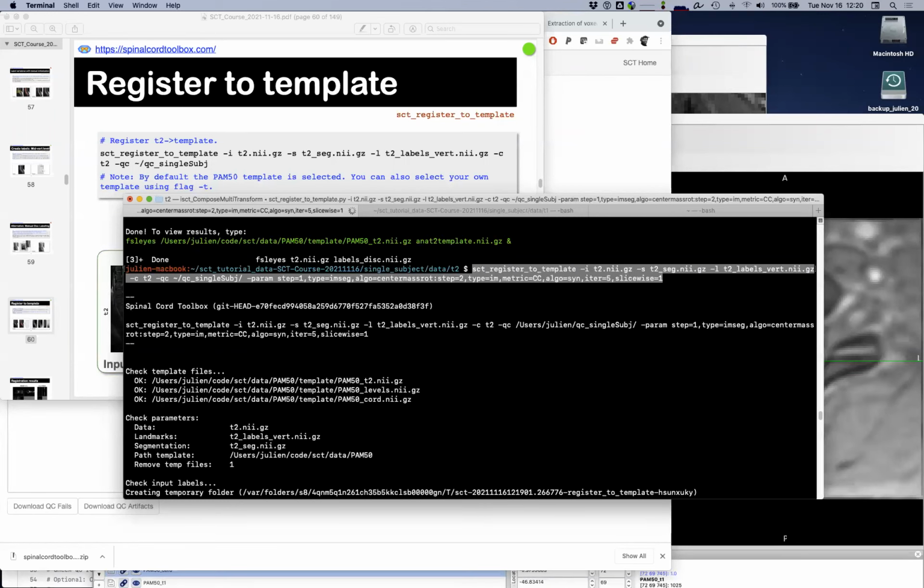So we wanted to show the comparison between PropSeg and Deepseg. That's why there is a bit of a mix between the two commands in the course. But moving forward for your study, I recommend you start with Deepseg and see if you're happy with it. Okay, so use everything T2 contrast with Deepseg, all the way down to what we've done so far, right? Exactly. Thank you.